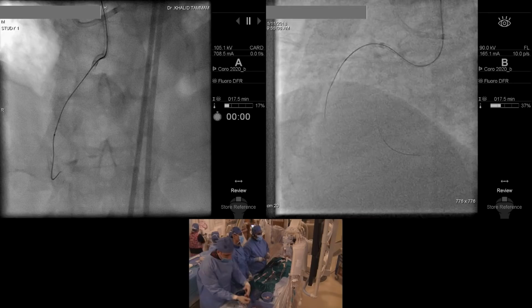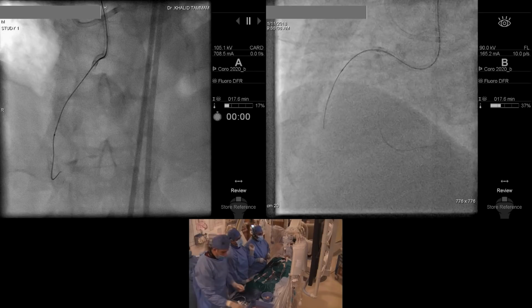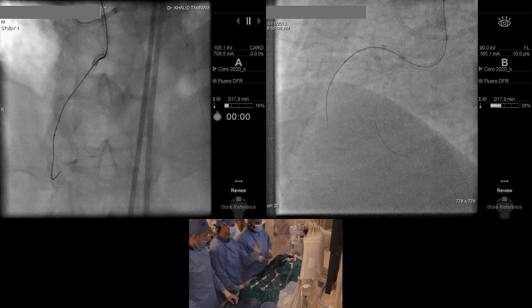Actually, this is unique for Gaia. I noticed when there is a calcium, it can get stuck to it and may unravel if we pull it. So we need to rotate the opposite of the last movement in order to free the wire from the calcium. Not necessarily, the problem here is not the calcium.